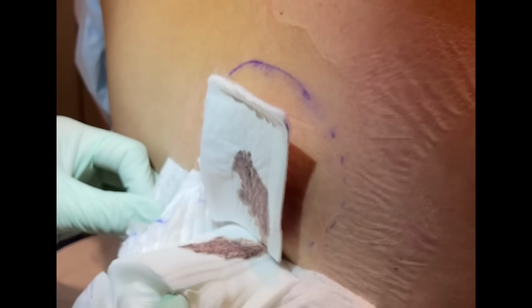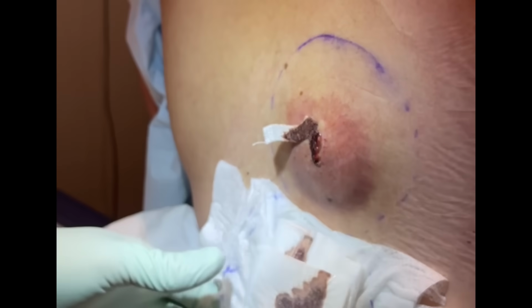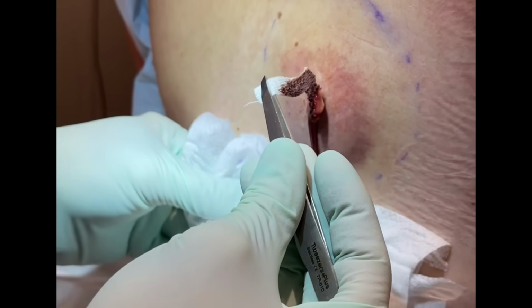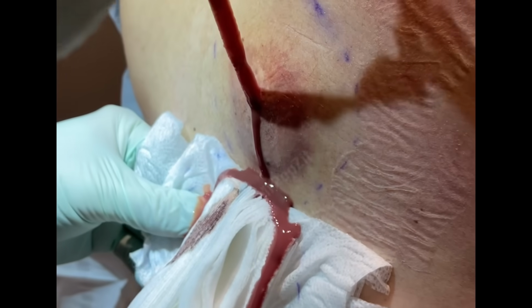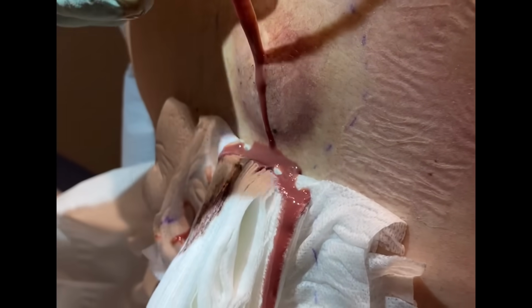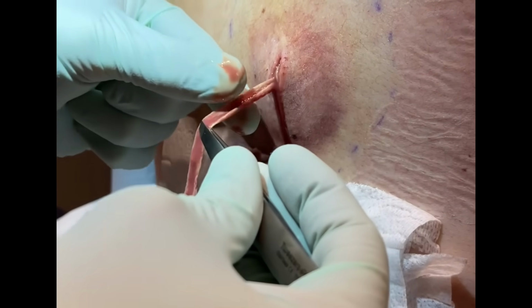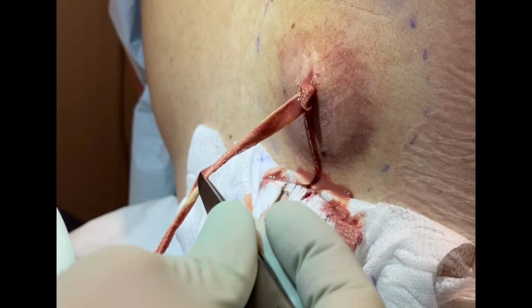Okay, that's good. A little bit of drainage, but not too bad. Perfect. We're probably going to get some fluid that comes out as I pull this out here. I can already see. There we go. Yeah, that's why we put that down, because this was very juicy. It's going from yellow to brown now, though, which is good. So you are definitely producing a lot of purulent discharge in here. So that antibiotic is going to be very important. There we go.